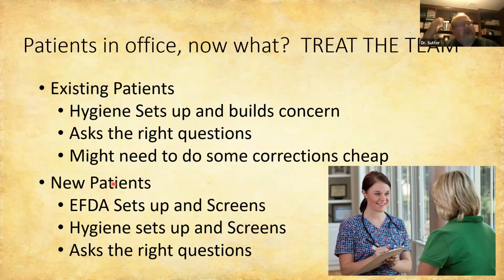And so patients that are coming in that have multiple handles, this is something you might think about if you go down the road and you start getting really comfortable. Running around the office with one T-scan from op to op makes about as much sense to me as running around the office with one X-ray head. No, you have an X-ray head in every unit because every op needs one to check things on the fly.